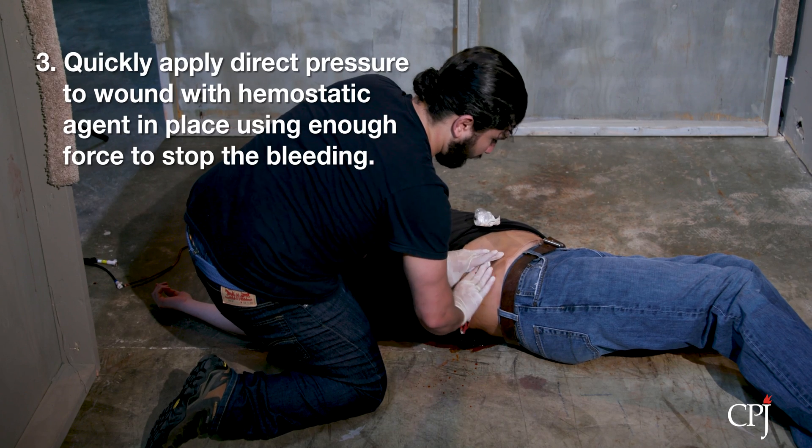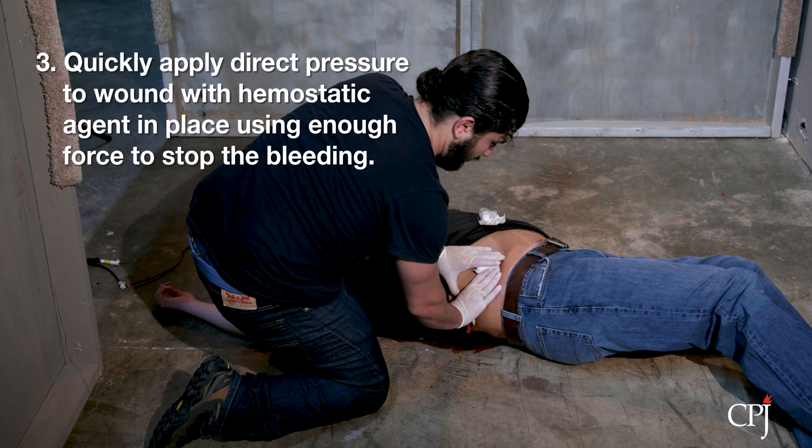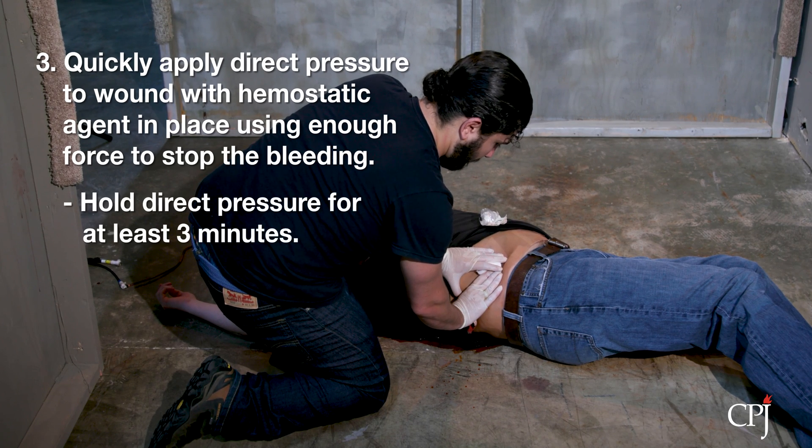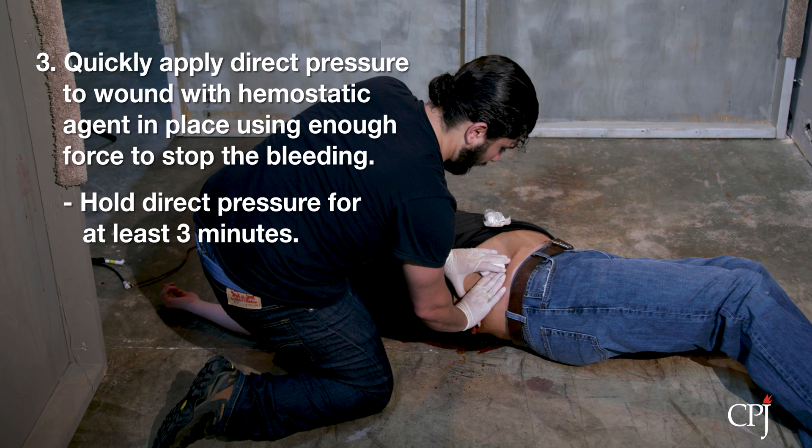Quickly apply direct pressure to the wound with the hemostatic agent in place with enough force to stop the bleeding. Hold direct pressure for a minimum of 3 minutes. Reassess the wound to see if bleeding has been controlled.